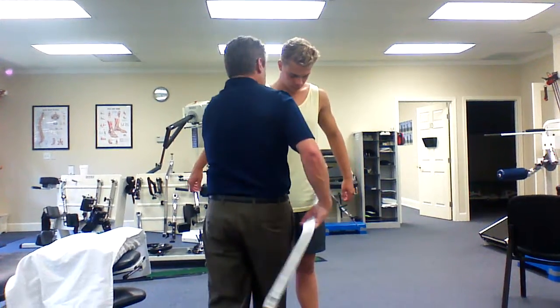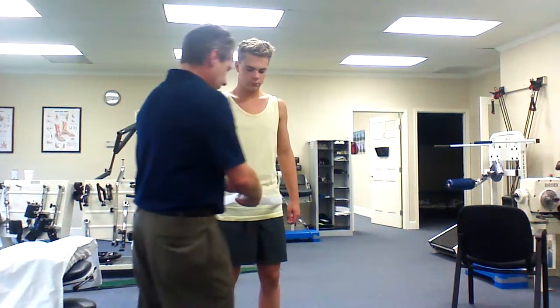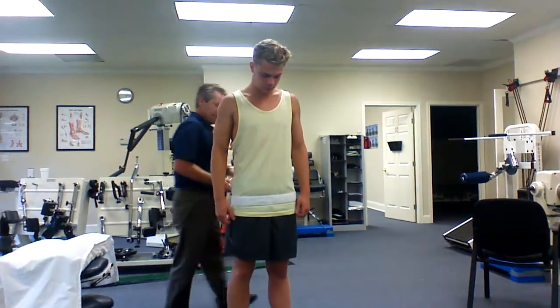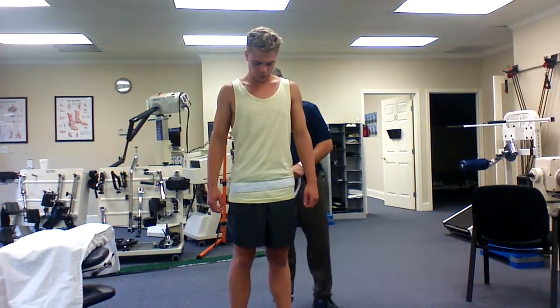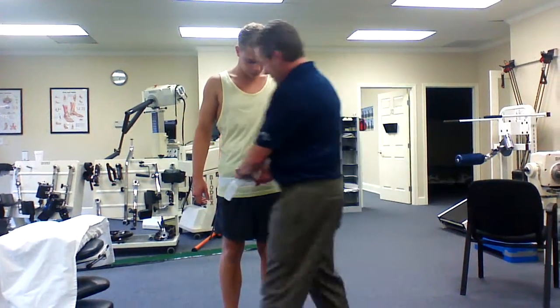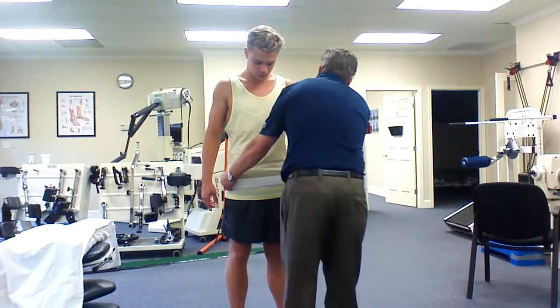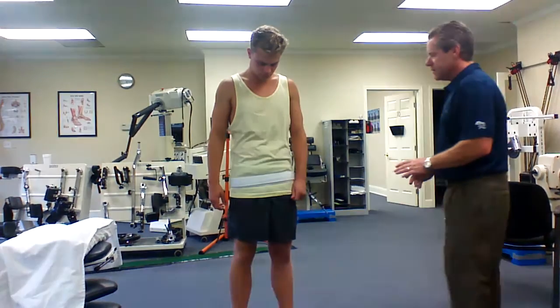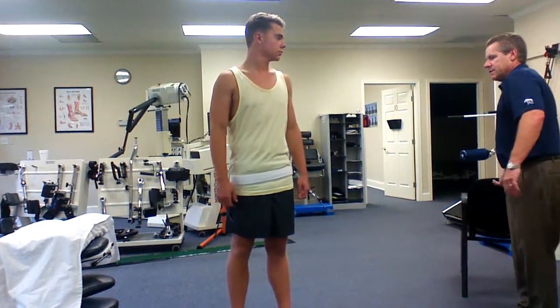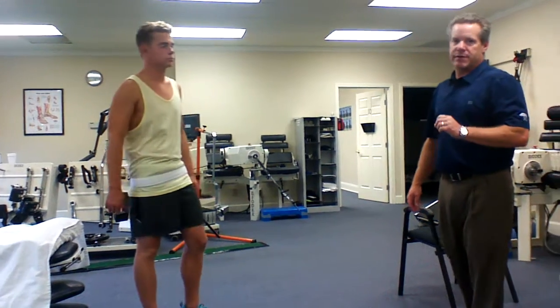If I didn't know the person very well, I probably would not hug them when I'm doing this. I'm going to wrap this around you — I've made it a little bit more difficult than it needs to be, but I'm going to cinch that thing up and go all the way around. You can see that's pretty darn low, but the idea is to tie the pelvis together. The real test will be to just have the person walk around — this should be something that you get instant relief from.